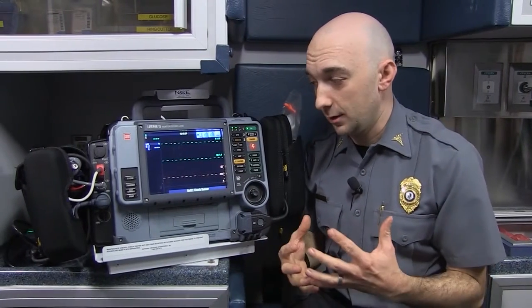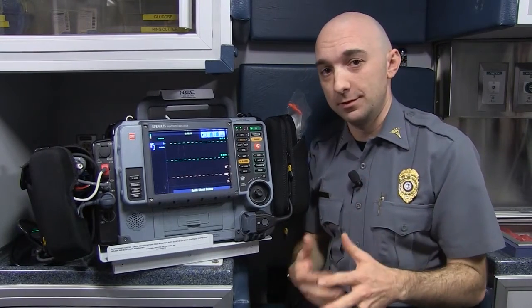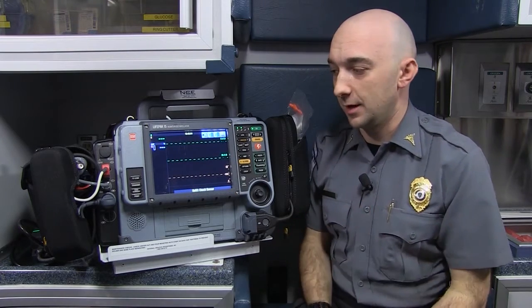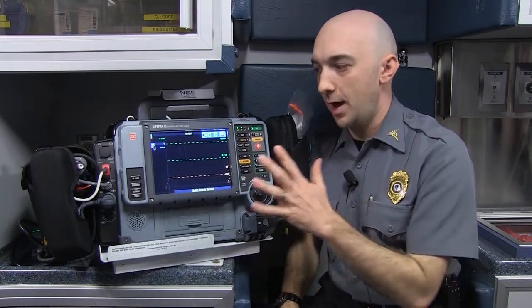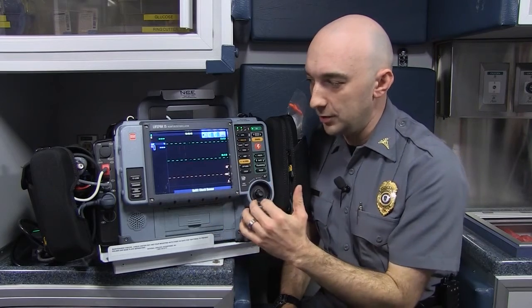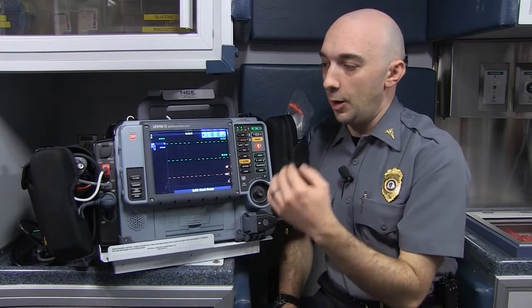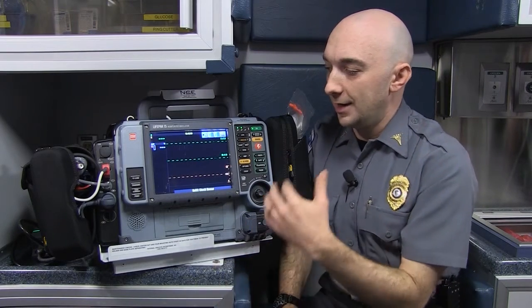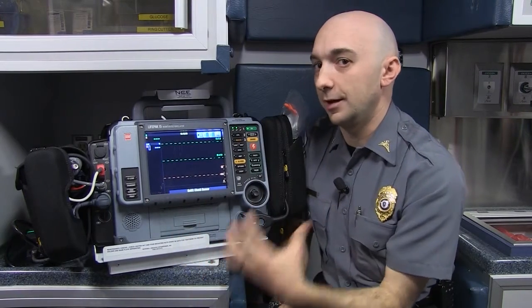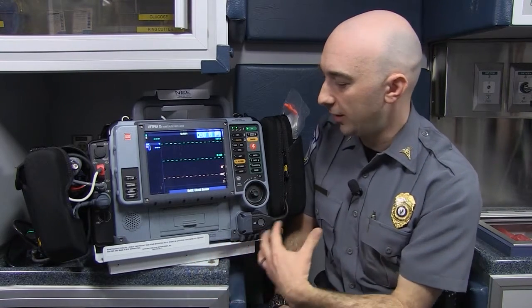This is our cardiac monitor. This is what allows us to really diagnose or take a look at what a patient's heart is doing and then make very important treatment decisions based off of this — something that a lot of time is spent analyzing in paramedic school. We get to look at what a patient's heart is doing electrically, and this monitor also allows us to monitor oxygen in their blood, something called end-tidal CO2 — how much carbon dioxide they're blowing out of their lungs — and that tells us physiologically how somebody's doing.